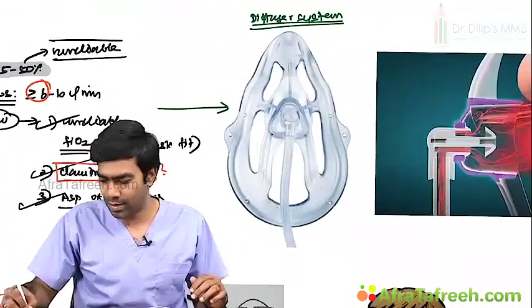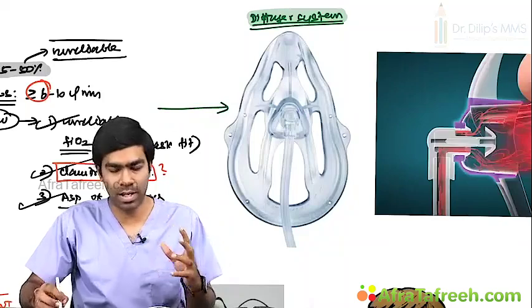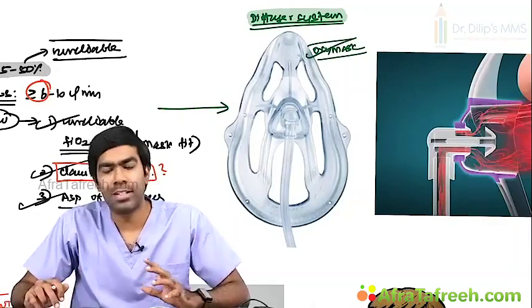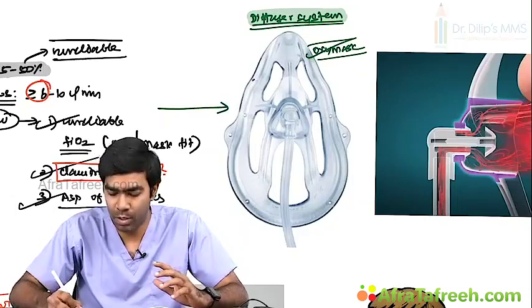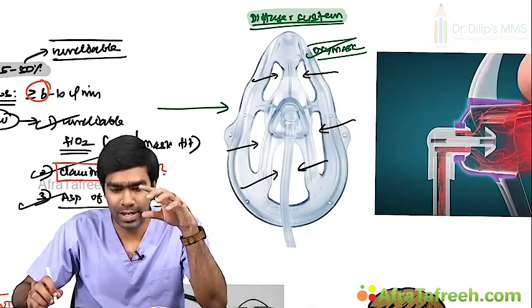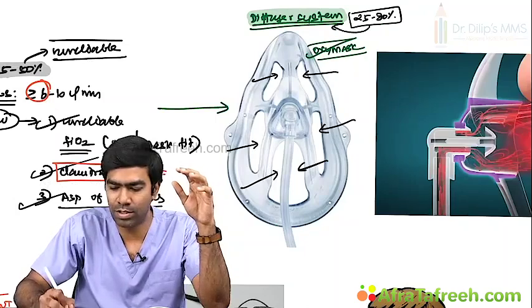But on the other hand, we didn't complete the discussion on the diffuser system. So these are masks with a diffuser system. This is a patented diffuser system that only one company has. That company name is Oxymask. You can see how big the holes are in this mask. Still, they can deliver an FiO2 of approximately 25 to 80% because of the special diffuser system they have.